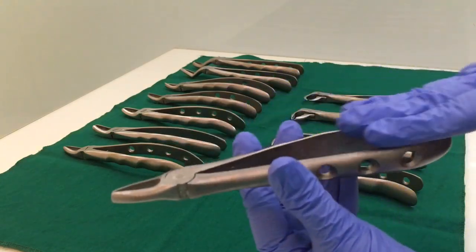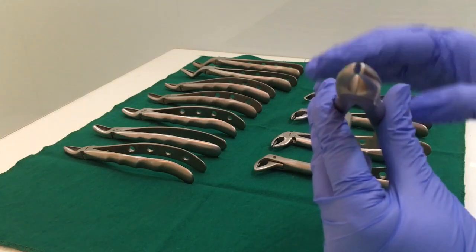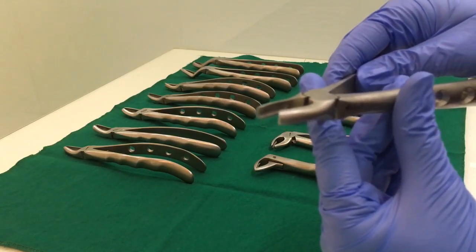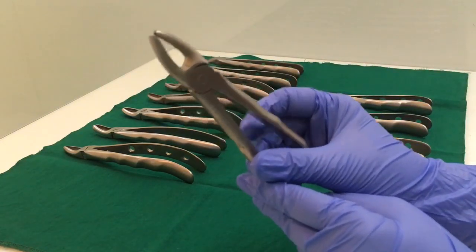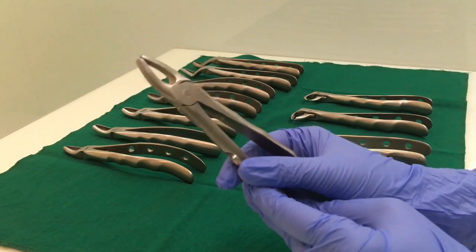The anterior forcep, apart from having a straight or flat handle, will have two rounded beaks — both beaks are rounded. This is used for all the upper anterior teeth: lateral incisor, central incisor, as well as the canines.